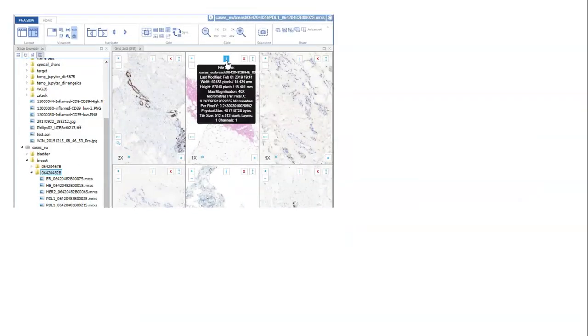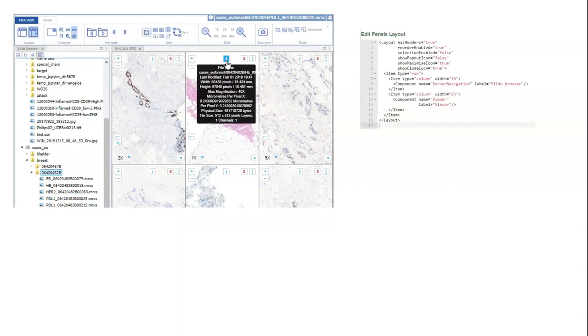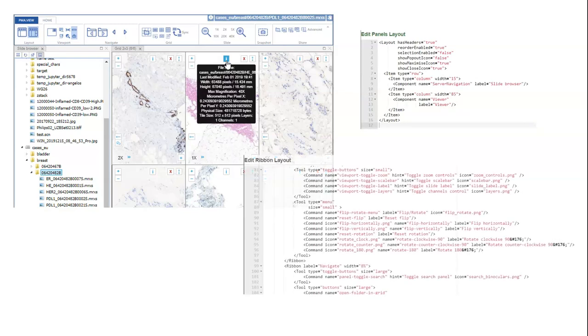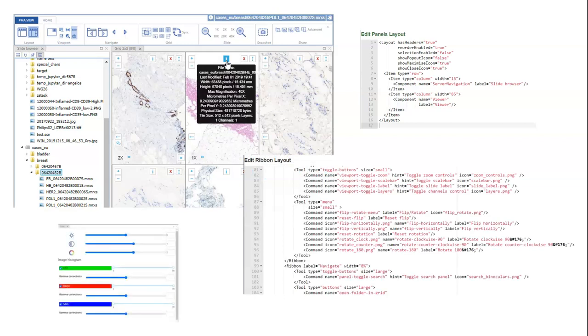Correspondingly, Pathomation offers PMA Studio, which has a panel-oriented layout. The organization of the panels is fully configurable via XML, as is the ribbon. And last but not least, custom panels can be added and integrated into the standard layout schemes.